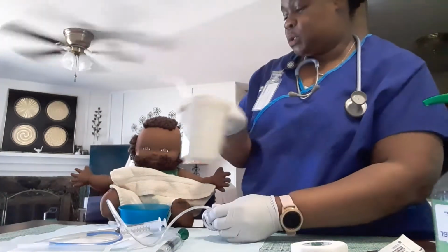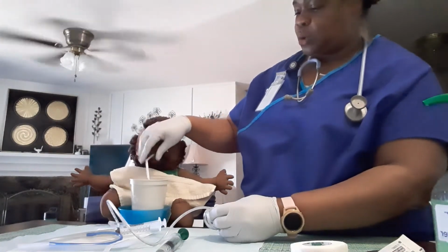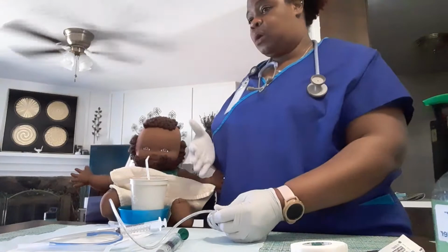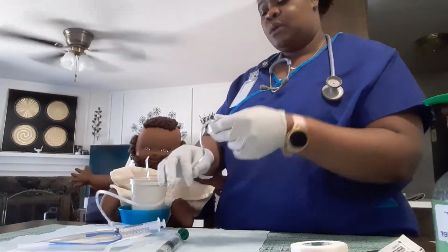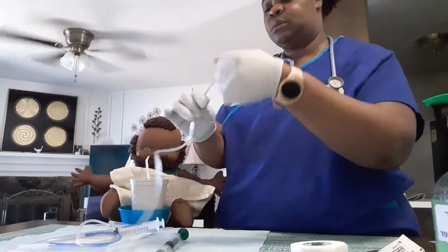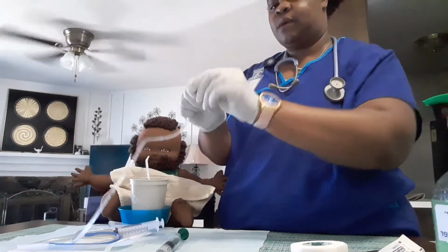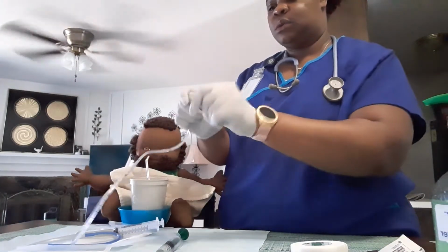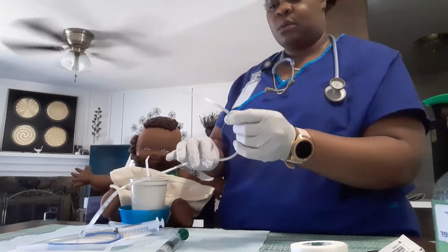And while I'm doing all this, I'm going to give my patient a cup of water with a straw. And I'm going to let him know as I advance this down, I'll have him take sips of water. So I have my tubing, and I'm going to curve it so it'll go in. So that's a little bit better.